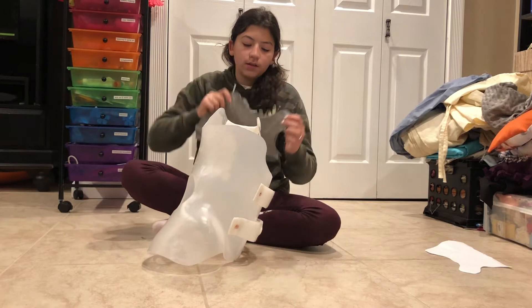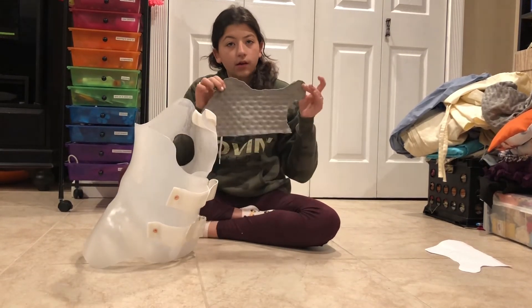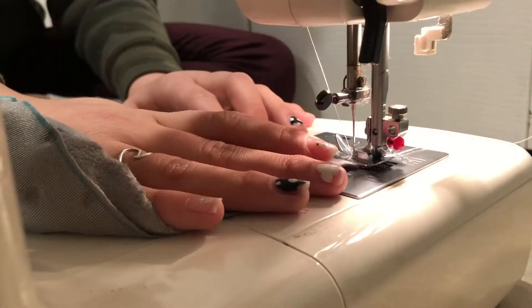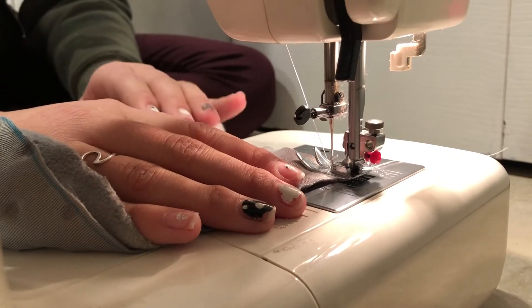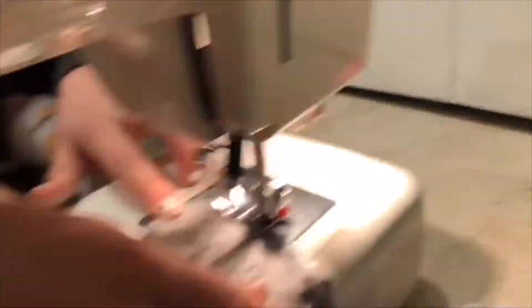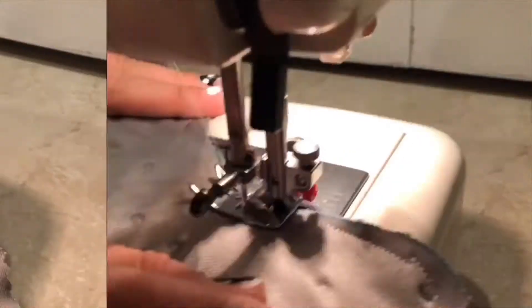As you can see, it fits — I can only do it from the inside, but it fits. Now we are going to come in close up and sew around the edges. As you can see, we're starting to sew now, and we're just going to speed up the process a little bit.